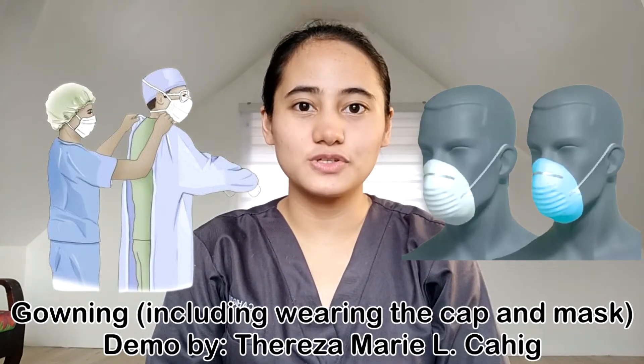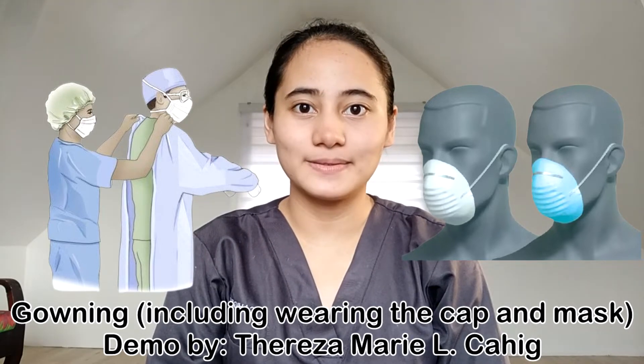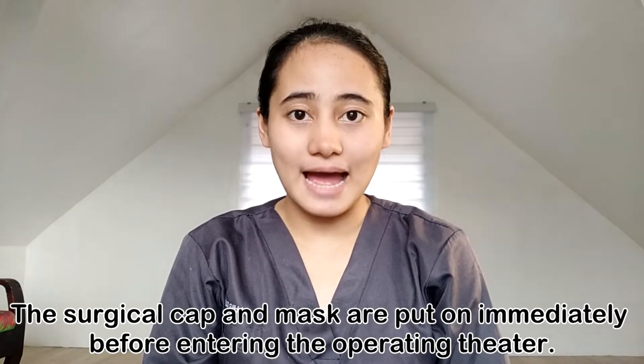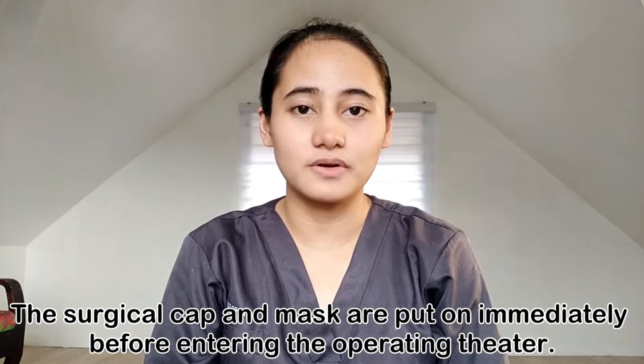Hi, I'm Teresa Kahit and now I am going to demonstrate gowning and how to put on surgical cap and mask. The surgical cap and mask are put on immediately before entering the operating theater.